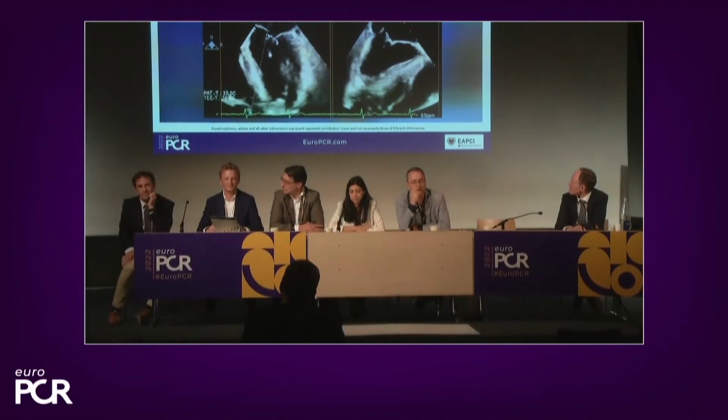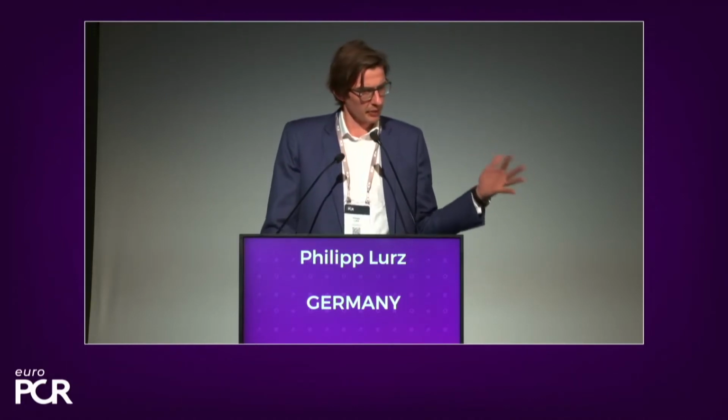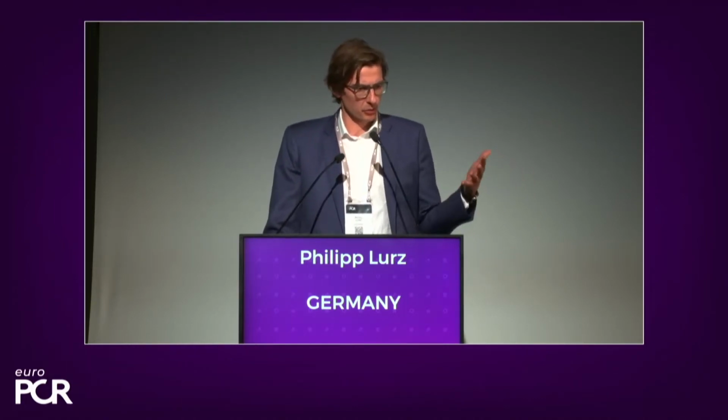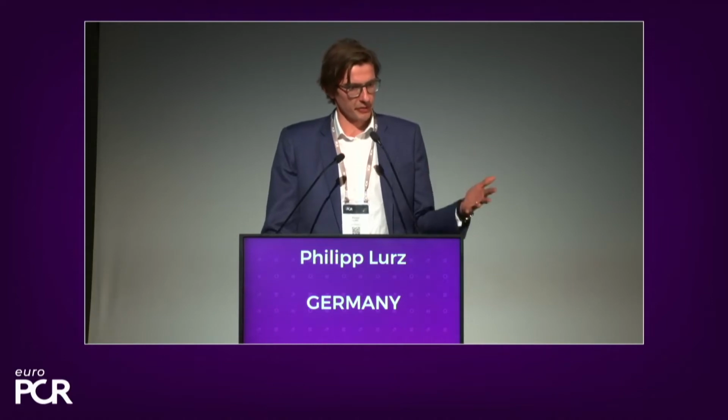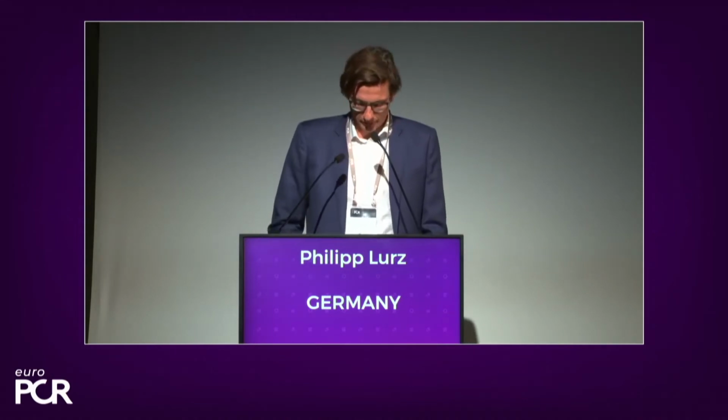Yeah, we thought so too. We weren't entirely sure whether it's an additional leaflet or whether it's P3 or A3, but obviously it's a commissural pathology. It is a massive MR, and as you said, there is some tissue which can be bridged, and that was the treatment goal.